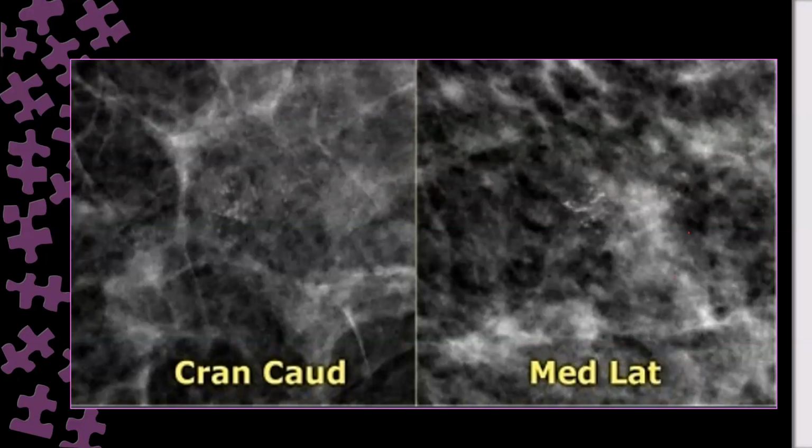This is important. Did it change in shape or in distribution or both? Both. Excellent. Okay. But at least the most important is the change in morphology. This change of morphology is important. Does it become more obvious or less than in the CC? More obvious. Yeah.